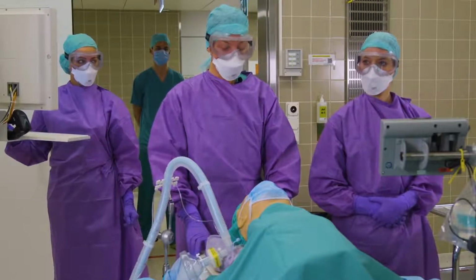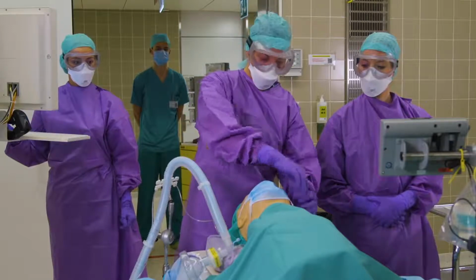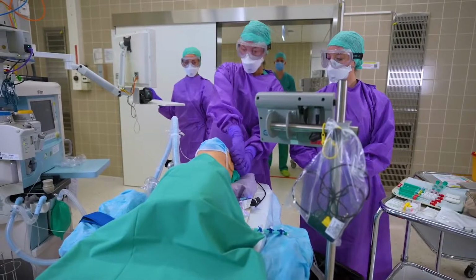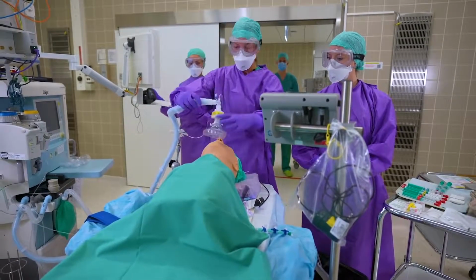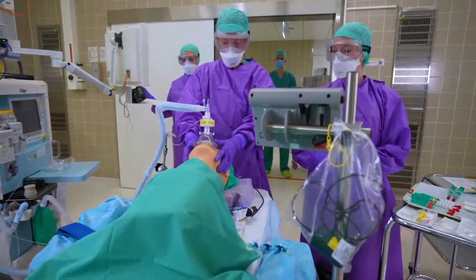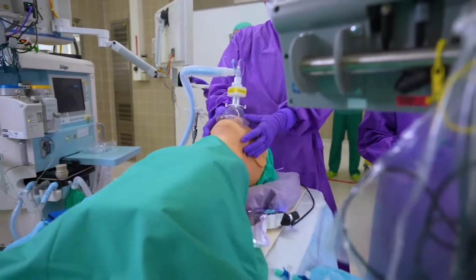We are starting with an adequate pre-oxygenation for about 3 to 5 minutes. As you can see, our patient is wearing a surgical face mask, which of course we have to take off. Then we will pre-oxygenate, and here it's important to have a tight-fitting mask to avoid any leakage.